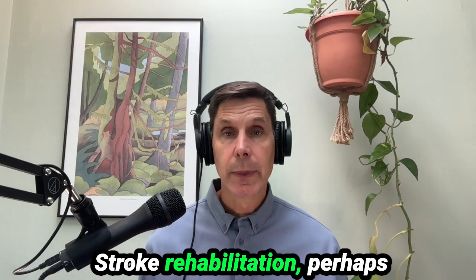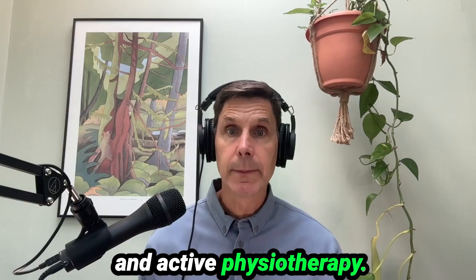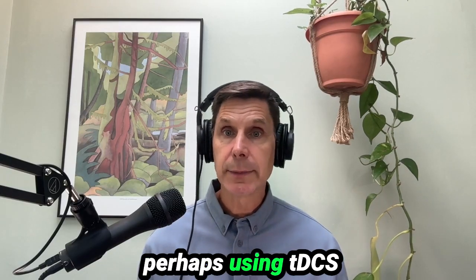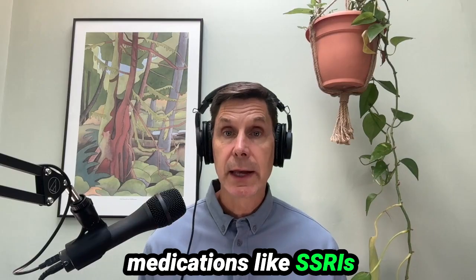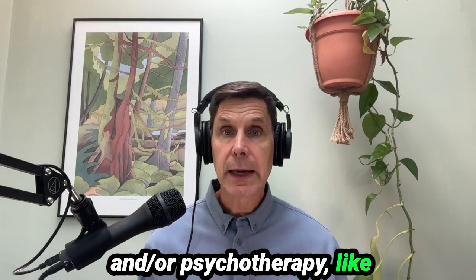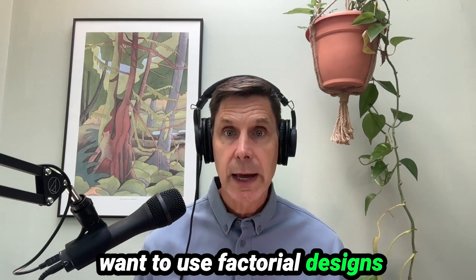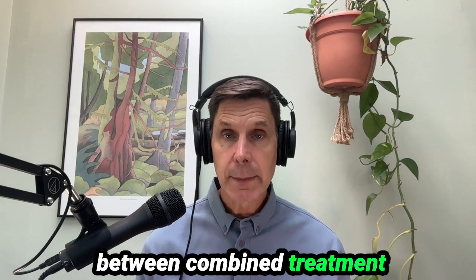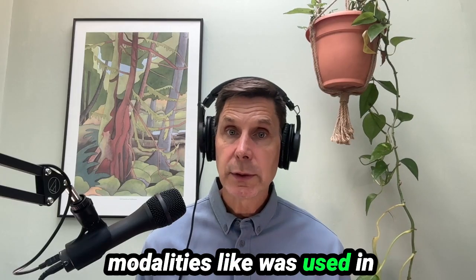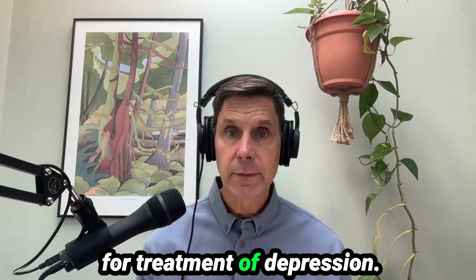Stroke rehabilitation, perhaps using combinations of tDCS and active physiotherapy. Depression treatment, perhaps using tDCS in combination with medications like SSRIs and or psychotherapy like cognitive behavioral therapy. So remember, when we're combining treatments, we want to use factorial designs in order to test for synergy between combined treatment modalities, like was used in the so-called Select tDCS trial for treatment of depression.